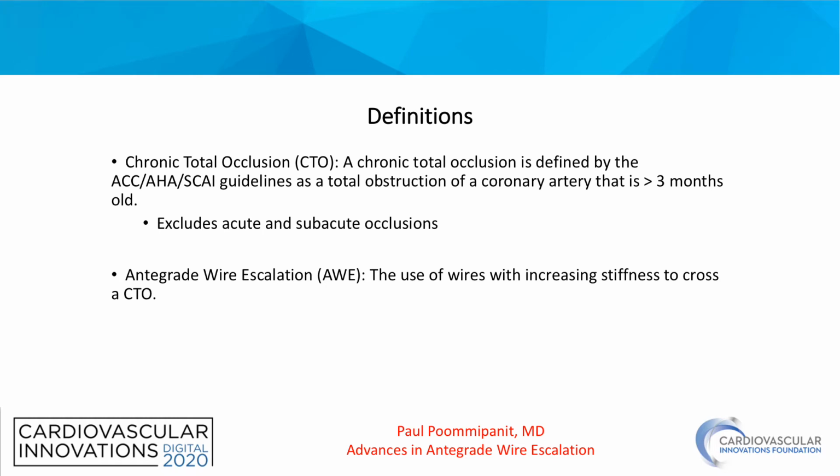Before we talk about antegrade wire escalation, I think it's important to go over some definitions. A chronic total occlusion is defined as a total obstruction of the coronary artery that is greater than 3 months old. This excludes acute and subacute occlusions.